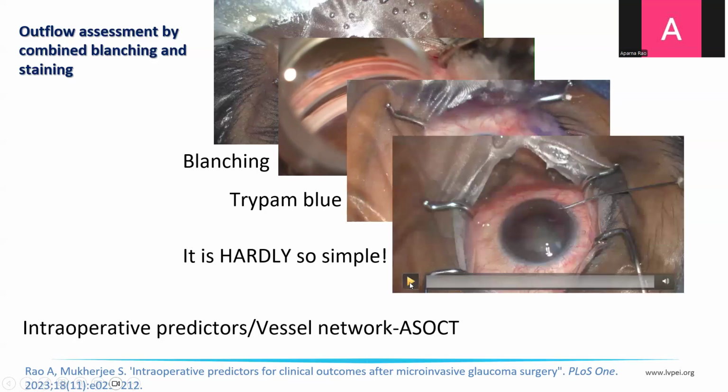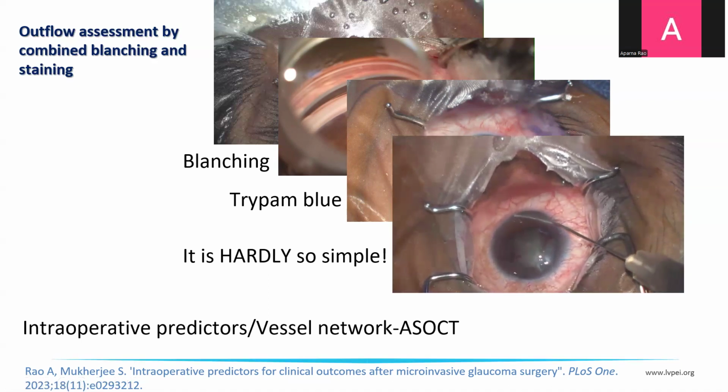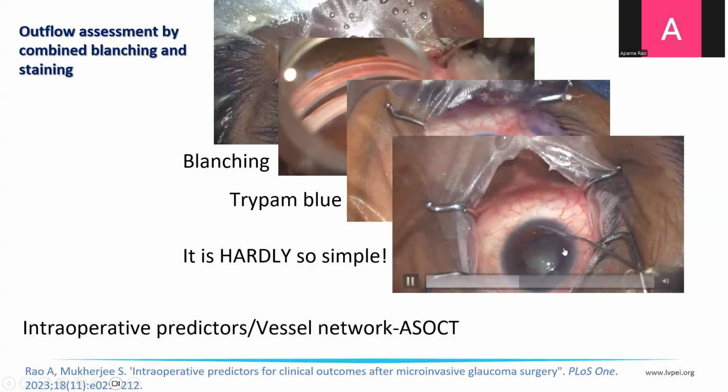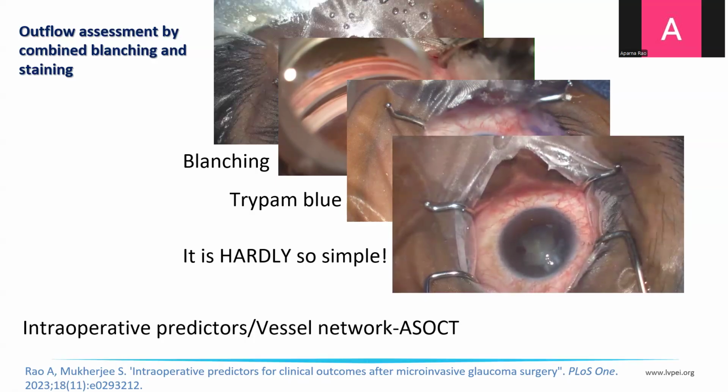Further, this video now showcases that the blanching that happens immediately after a forceful injection now extends after continued injections into more than 5 clock hours, as can be seen in this video, suggesting that certain collector channels have a pressure differential or a critical pressure for opening up.